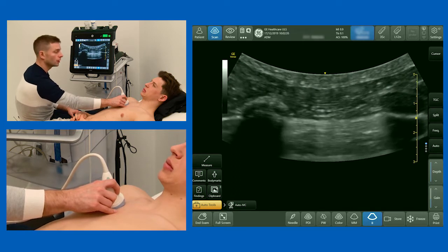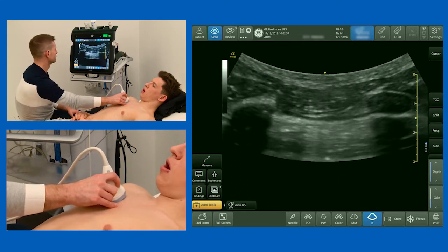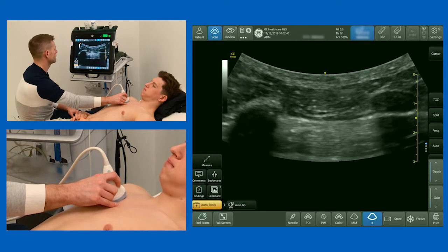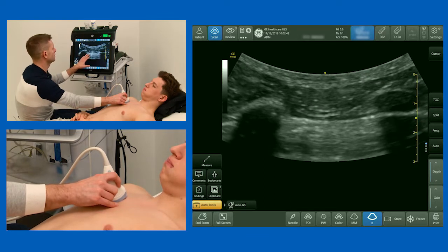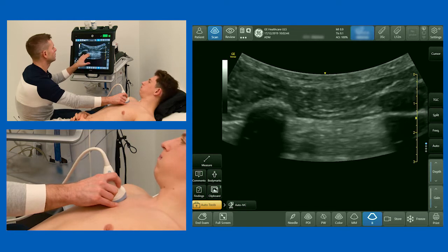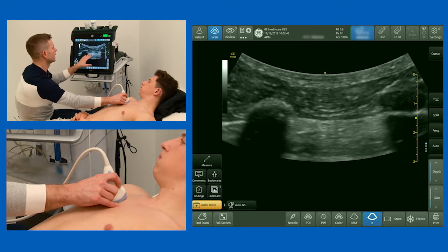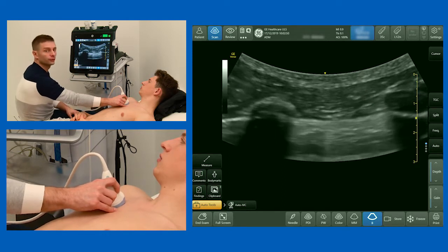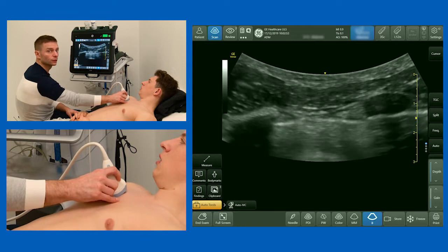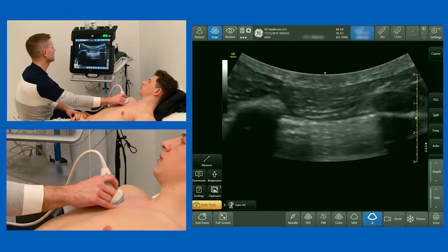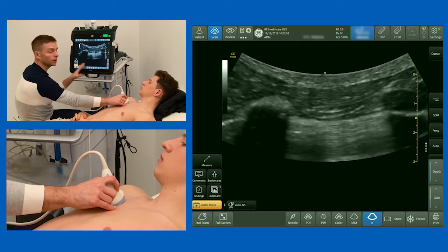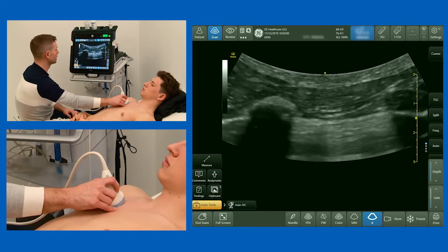If you can hold your breath — you can see the lung sliding has stopped. There is the occasional little bit of movement in time with the heartbeat, which is called the lung pulse. If there was a pneumothorax, we'd see no lung sliding and there'd be no lung pulse.